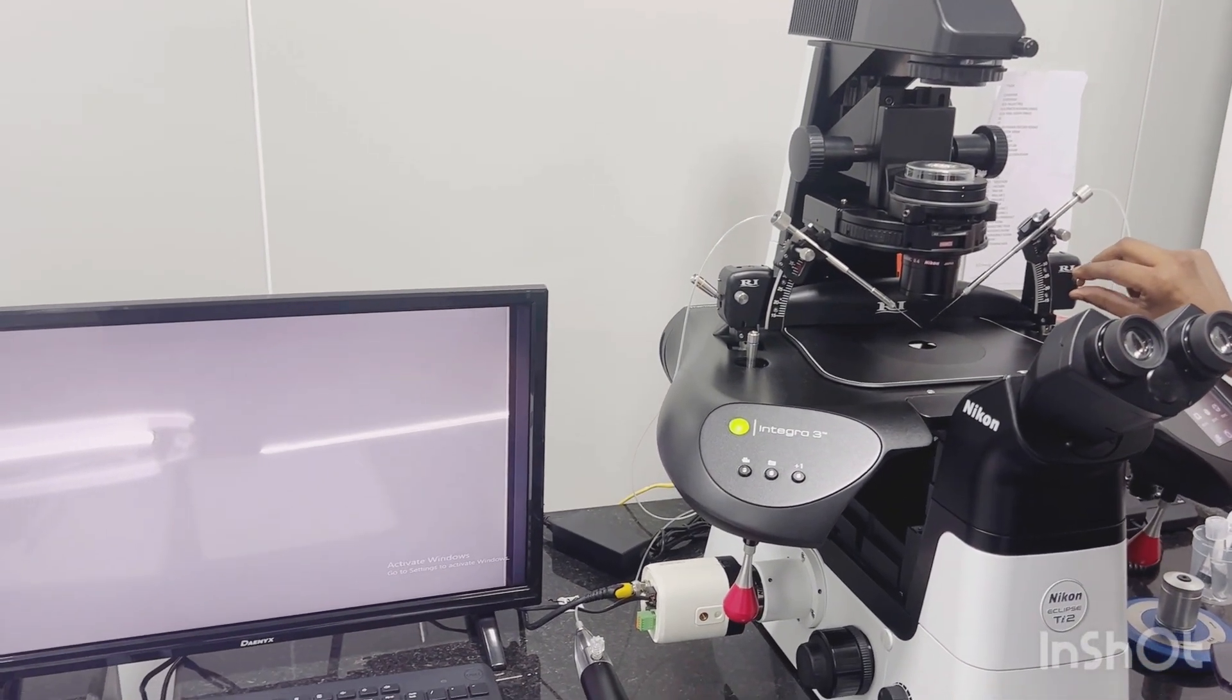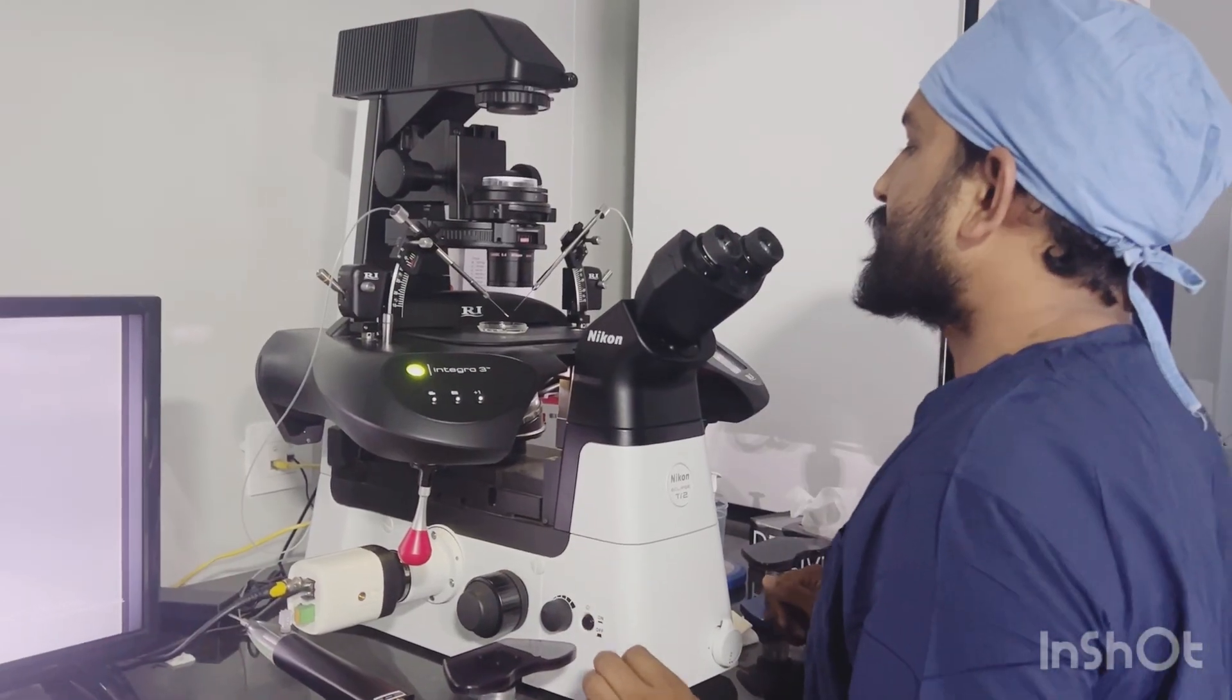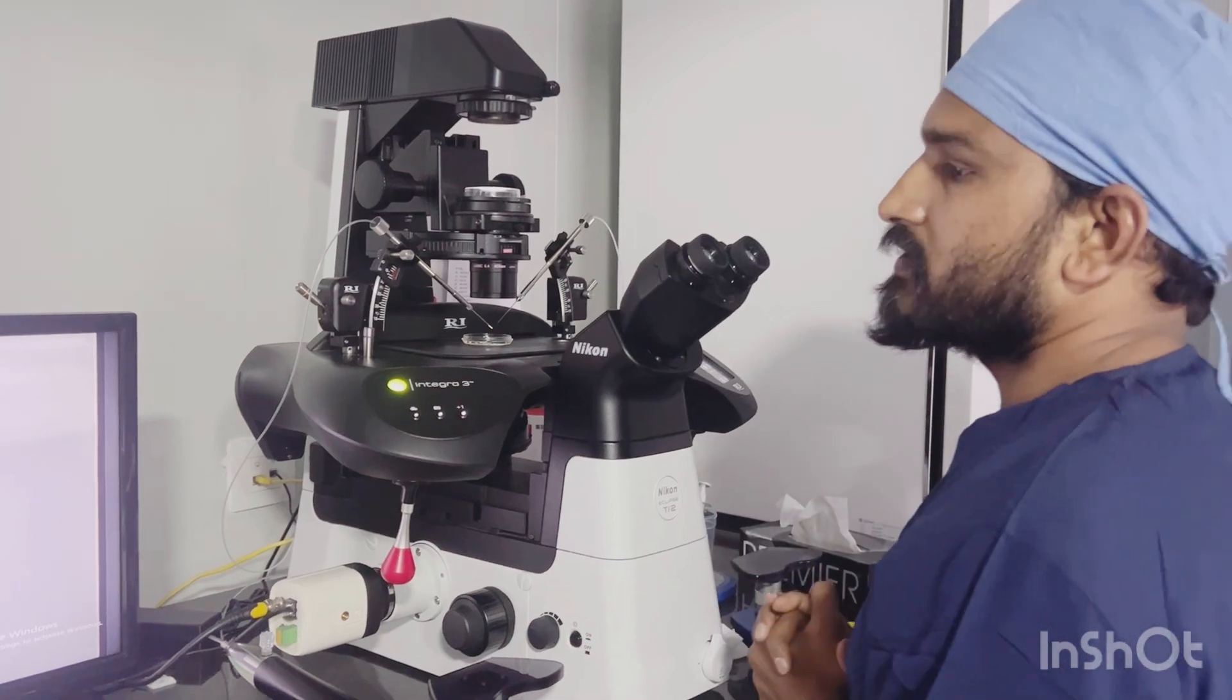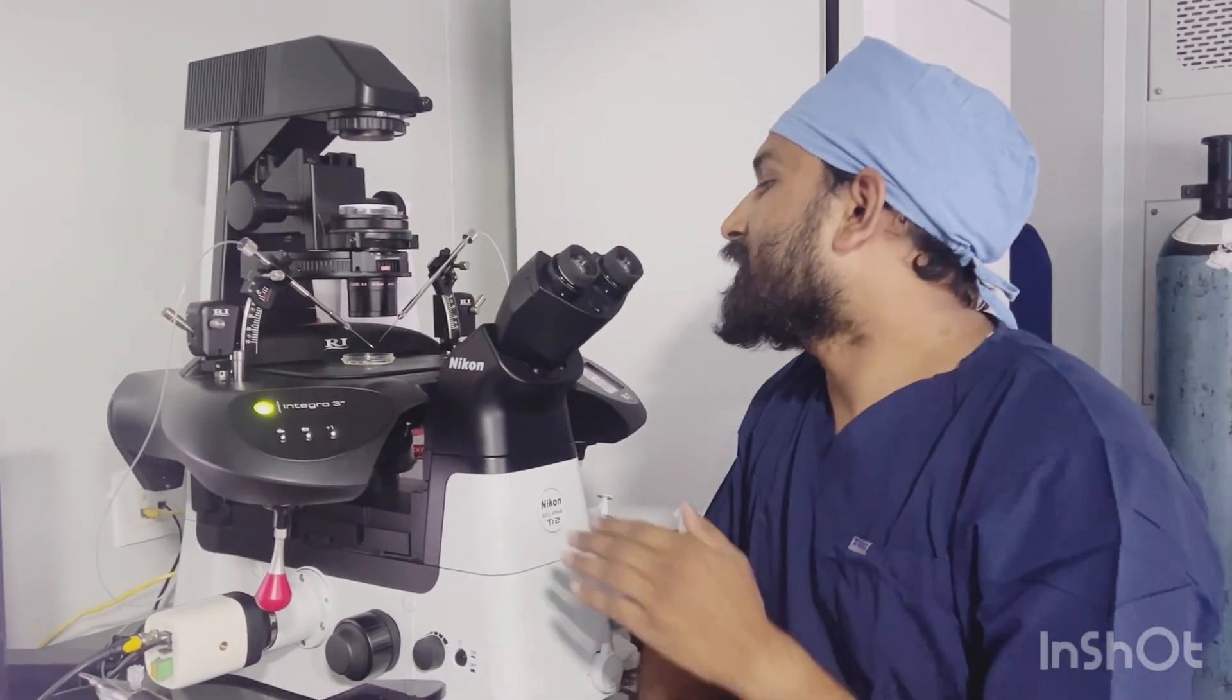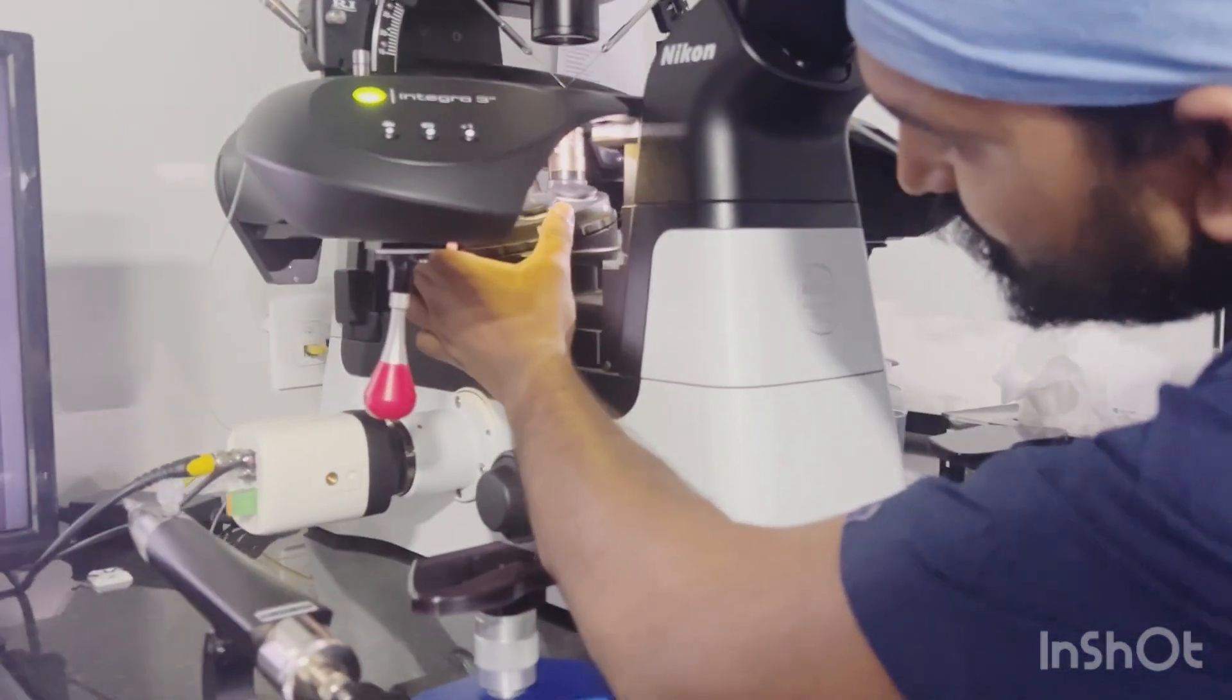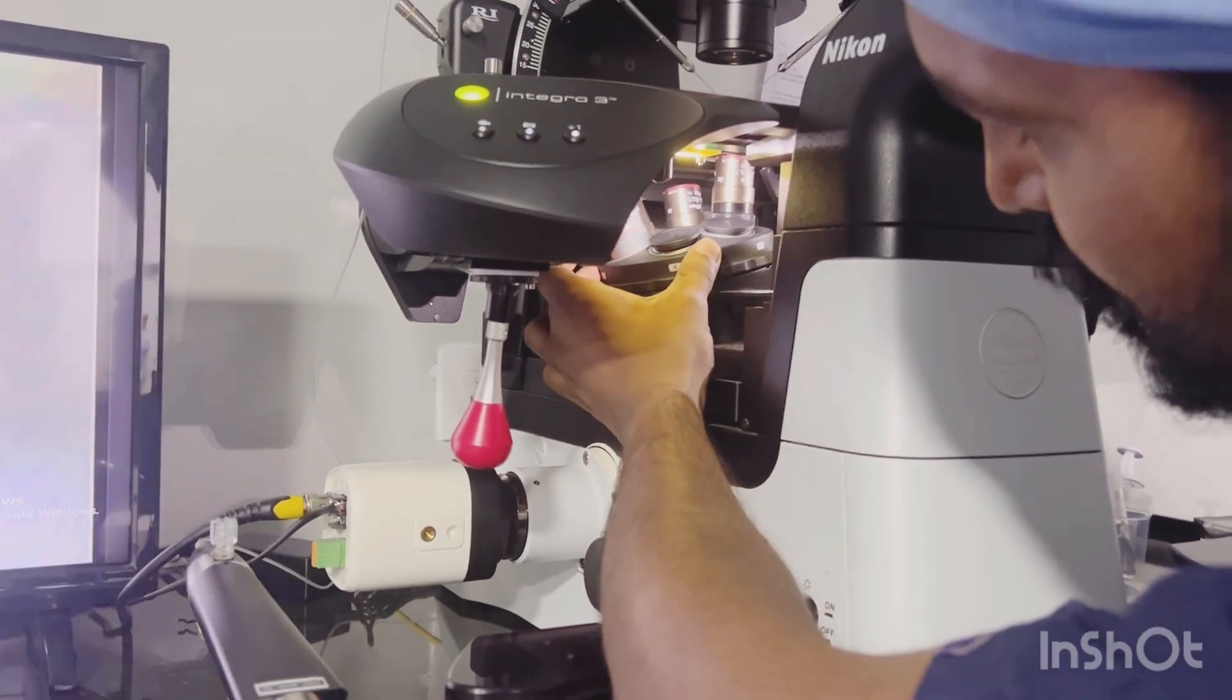Now friends, we have sperm within our ICSI dish. I have to align my injecting pipette in that drop of sperm. First of all, we are going to shift our objective from long 4x to small 4x.